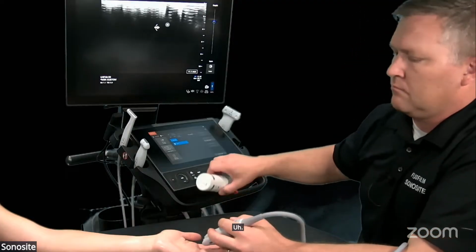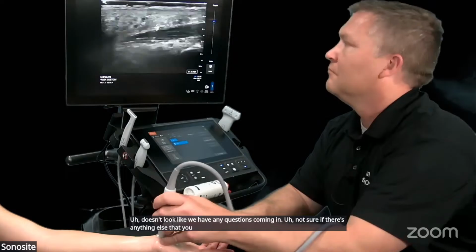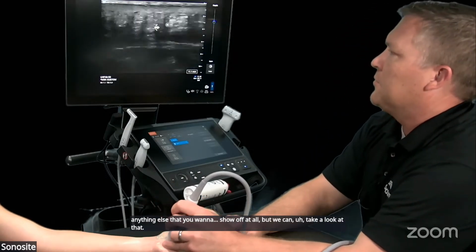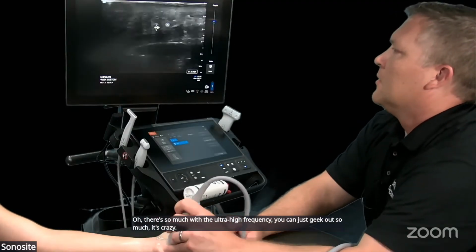Doesn't look like we have any questions coming in. Not sure if there's anything else that you want to show off at all, but we can take a look at that. Oh, there's so much with the ultra high frequency. You can just geek out so much. It's crazy. Oh, sorry. Just had one come in.